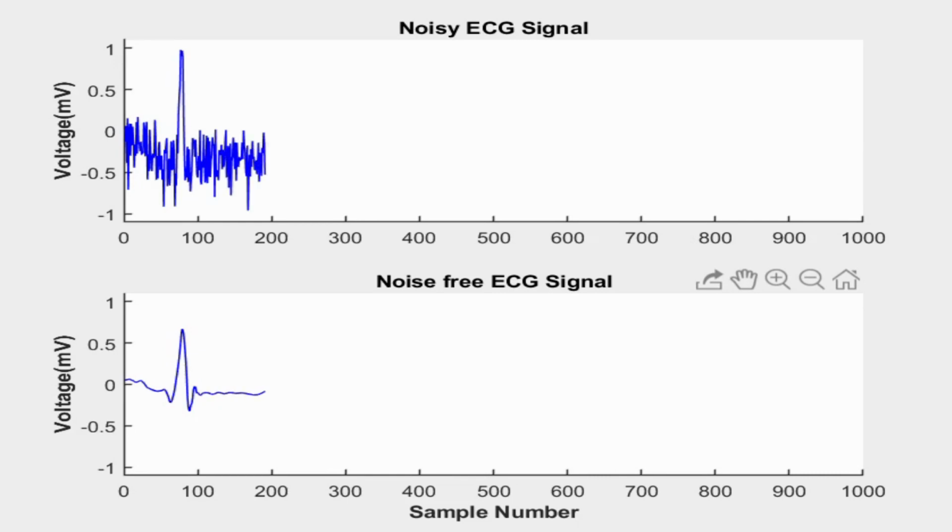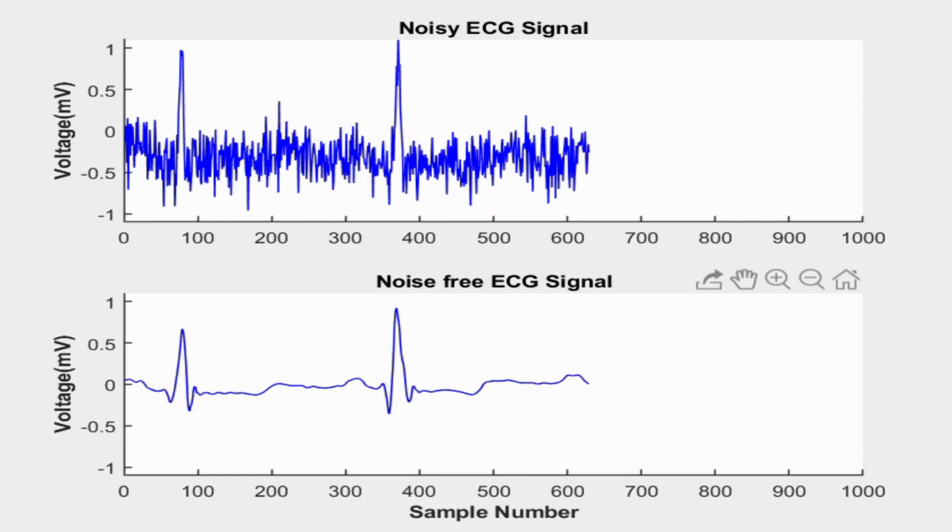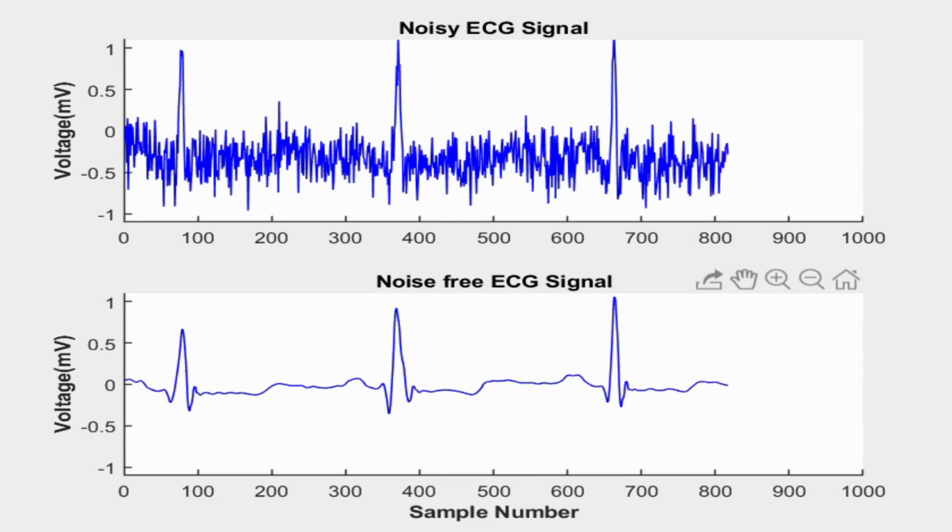For this purpose, discrete wavelet transform is exploited to decompose the signal into approximate and detail components. The approximations are the high scale and yield low frequency components of the ECG signal, while the details are the low scales and yield high frequency components of the ECG signal. Therefore, by retaining the desired coefficients and discarding the others, a noise-free ECG signal is obtained, which is ready for peak detection.